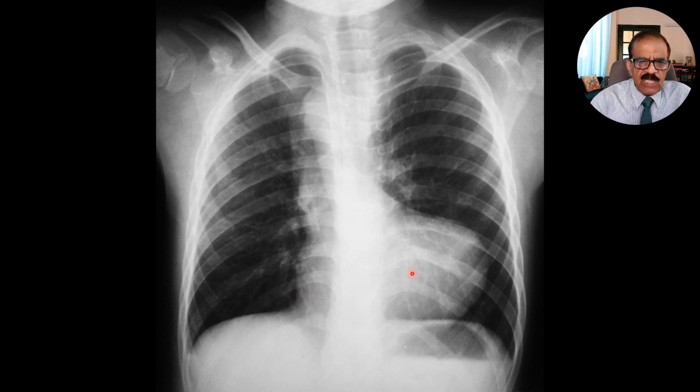So all these three observations, and cardiomegaly also: lifted cardiac apex, more concave upper left cardiac border, prominent right cardiac border, and cardiomegaly. I think these are typical features of a boot-shaped heart. If you look at it, it would definitely give you some impression of a boot. Now this is a feature of Fallot's tetralogy.